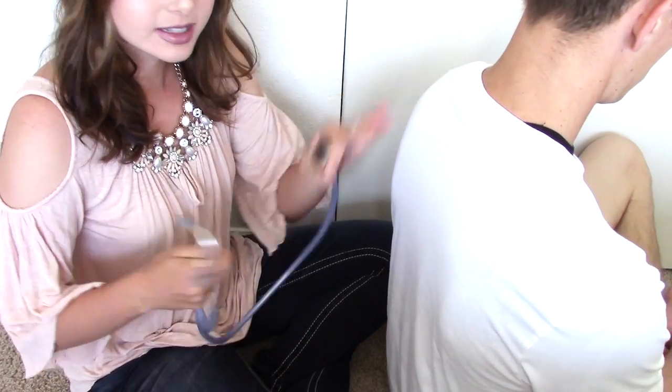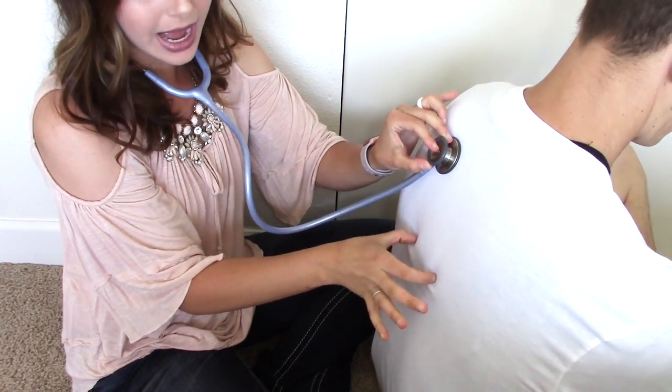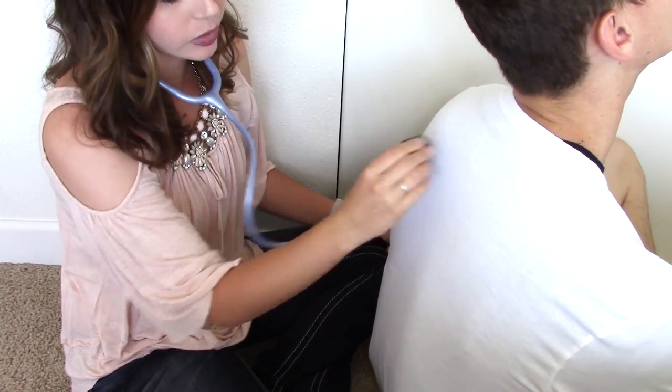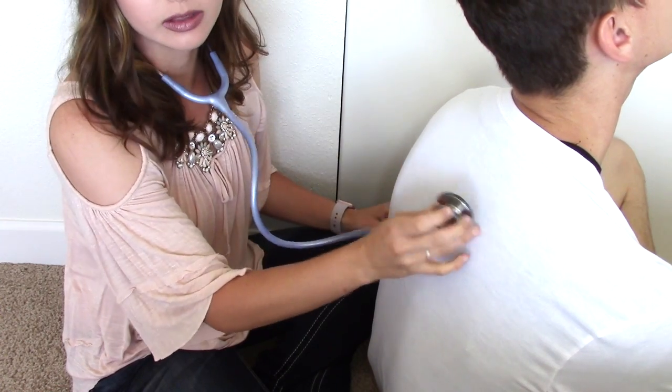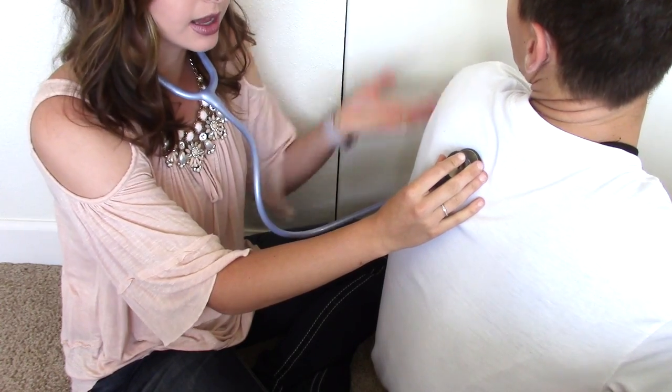I'm going to have you turn around. So this is Jesse's back. When I was in nursing school I was told there are like 10 or 12 spots to listen to, but honestly I say there are six. The first spots you're going to listen to are the top of their lungs, right down their back here, and you obviously want to listen on both sides. You don't want to go down one side first and then the other because you're comparing the lungs bilaterally. I start on one side and I always ask my patient to take a deep breath in and out.